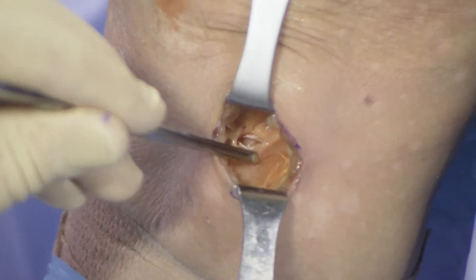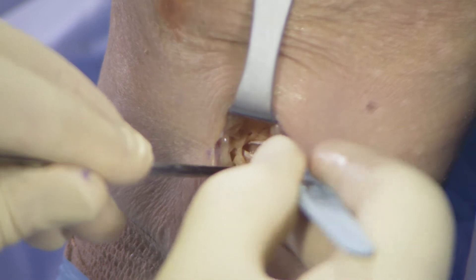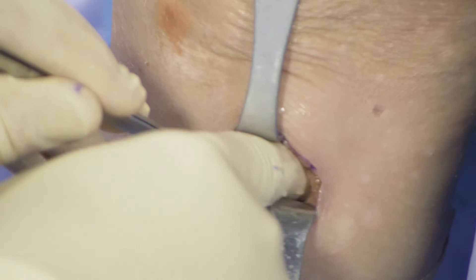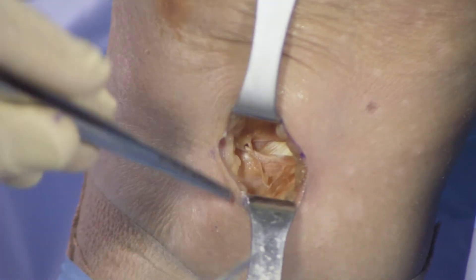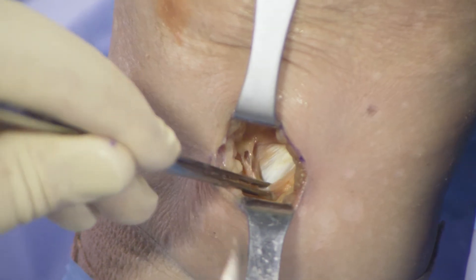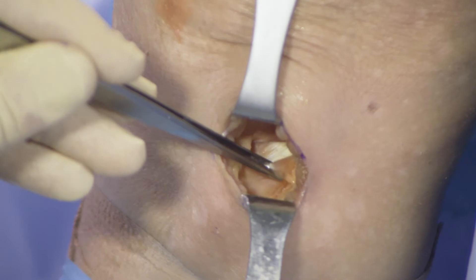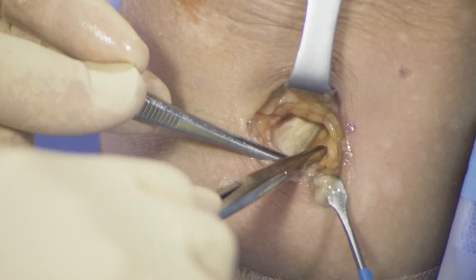There will then be a space that is immediately visible, and the medial collateral ligament will be seen below that. Typically the fibers are in the same orientation as the skin incision, so Metzenbaum scissors can be used to extend the incision in layer one. It's very useful to use a small ribbon retractor here to pull layer one forward so you can see beneath it.